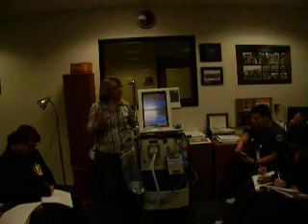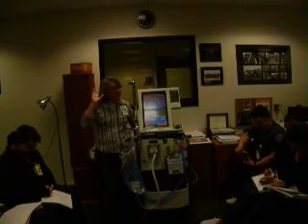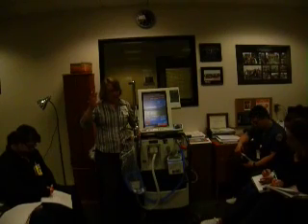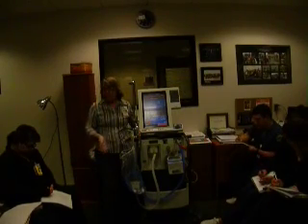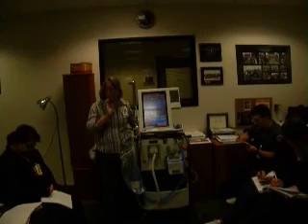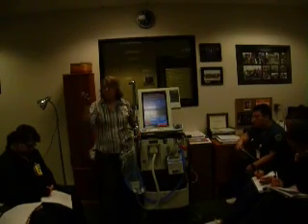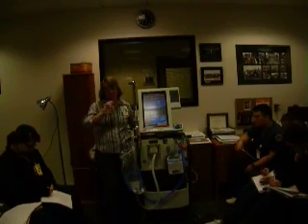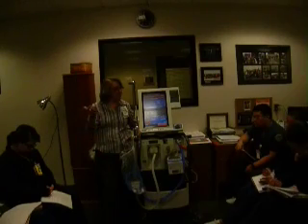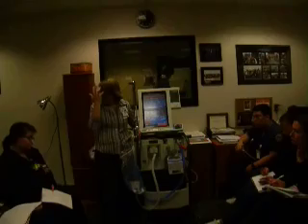Remember, and of course we're going to cover this in depth, assist control is the mode where the ventilator is going to give a mandatory breath even when the patient triggers a breath. So it's going to give your set rate. Say your set rate is 12, it'll give 12 breaths per minute. If your patient triggers more than 12, it's going to kick in and give the set volume or pressure that you have set. In SIMV, if the patient triggers a breath, it's going to allow the patient to take their own breath. So you can use either pressure or volume.